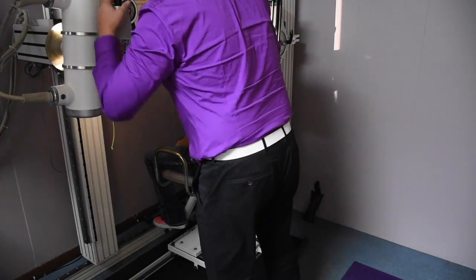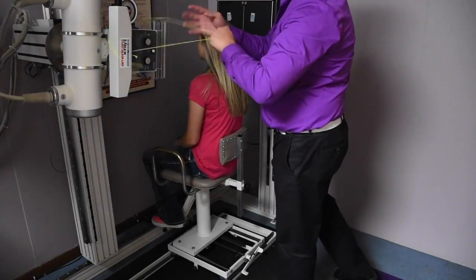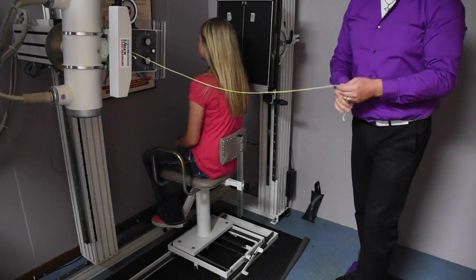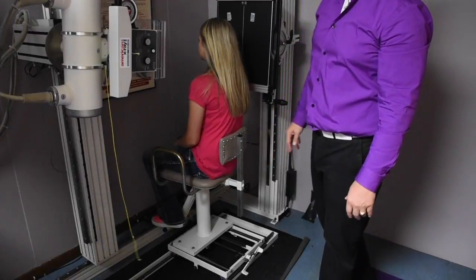Then line everything back up because points have moved slightly. So in this particular instance, you'll notice what we have done is match the patient's head tilt to fit that exact angle, so that way when we do our upper cervical analysis, everything is flat on the film for proper analysis.